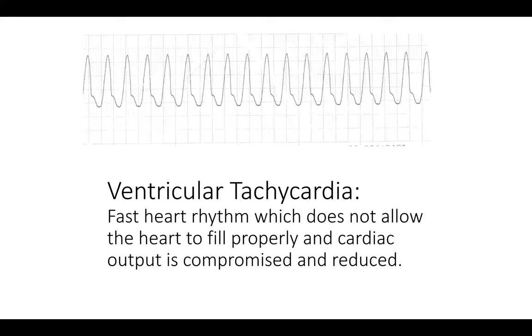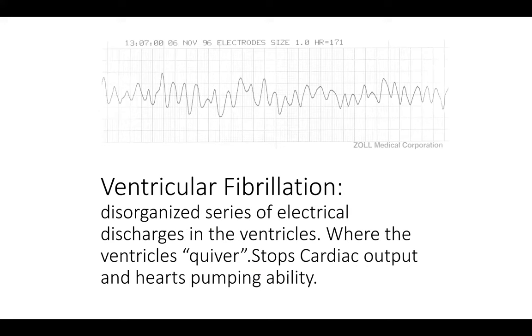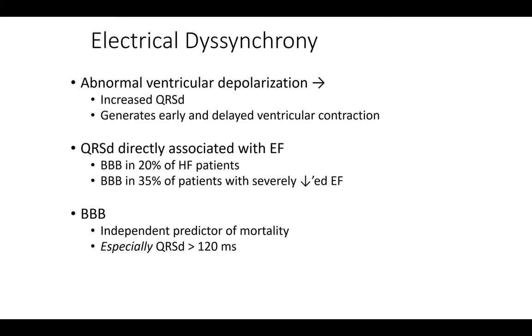So this is a patient with another one with ventricular tachycardia, also in heart failure with reduced ejection fraction. Either an ICD or a CRT may be evaluated in this group of people. Okay, so the reason for the CRT is because of the dyssynchrony. That is the key thing about CRT. The dyssynchrony is the main reason why we go for the CRT. Now, why is it dyssynchrony? There are various types of it.